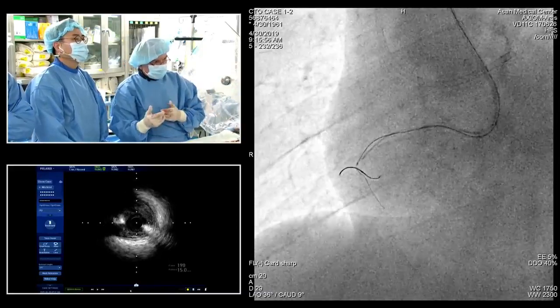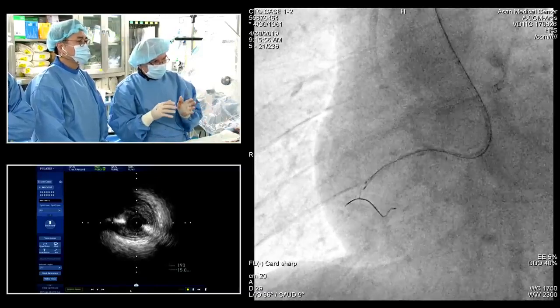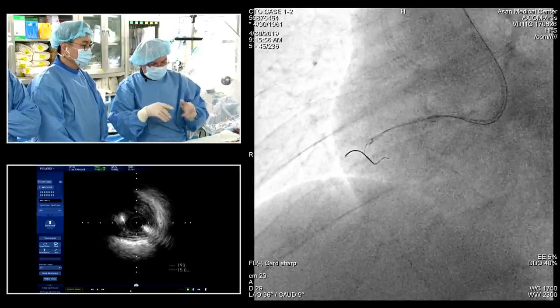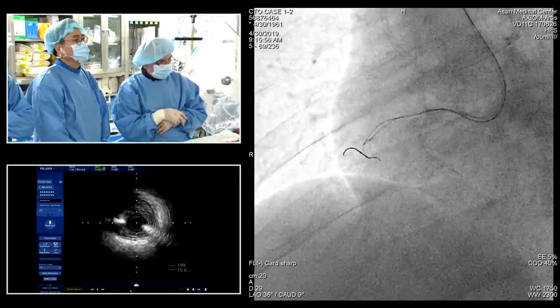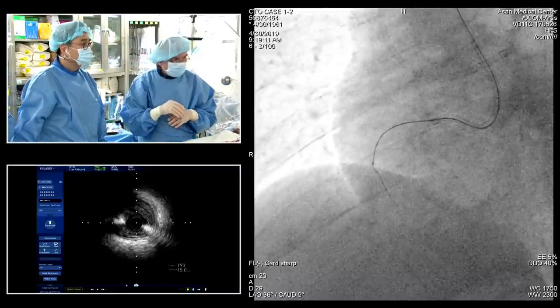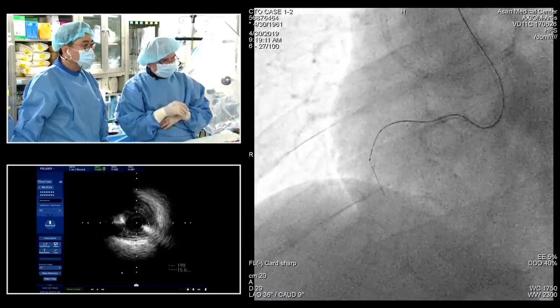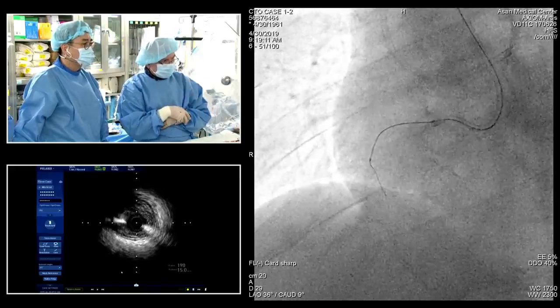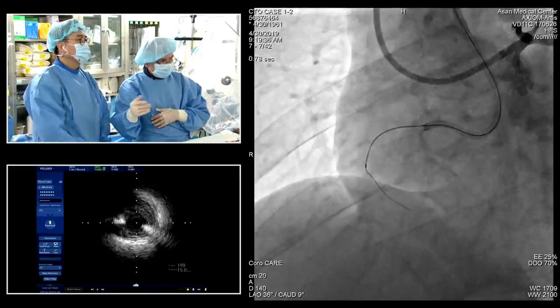but I couldn't follow with a microcatheter. So that's where we are right now. I removed the IVUS because there was some entanglement with the IVUS. So actually, we kind of destroyed the wire for the IVUS. And I couldn't advance the Fine Cross. You see, I tried the microcatheter, the guiding catheter is a little bit unstable. So we did an angio.